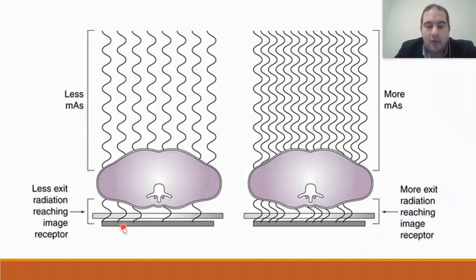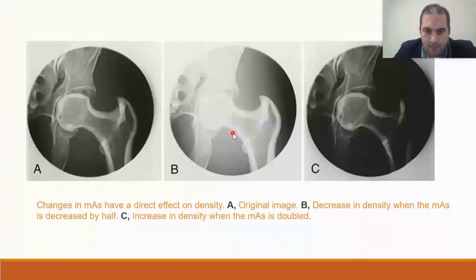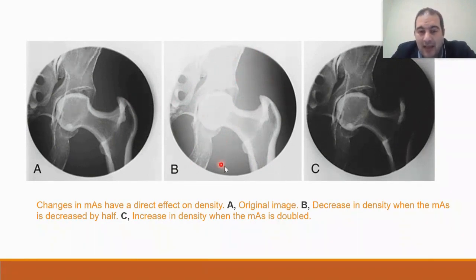In digital radiography, using increased milliamperes means, for example, that this image is our original image, and this is my hip joint. If I use a low milliampere here in this image, you will find that the image starts to appear like this, showing a decrease in quality. As I mentioned, you will find that the area I call my background has become brighter, as if the milliampere is not sufficient to deliver a significant number of X-ray photons to the film in this area, which is not enough to achieve the required blackening in the background or to reach the same signal as in a normal image.